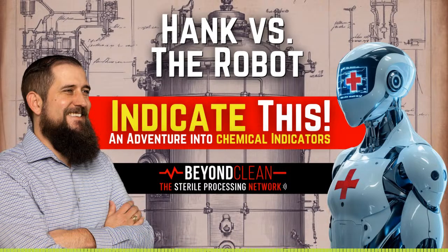Great starting point, Hank. You're absolutely right. There's a lot of confusion between chemical indicators and chemical integrators. So let's clear the air. A chemical indicator is like the basic gatekeeper. Its job is to tell you, hey, this load was exposed to a sterilization process. It's often single parameter, meaning it reacts to just one thing, like temperature or the presence of steam. Think of sterilization tape or those little stickers on the outside of a pack. They're great for confirming exposure, but don't dig into whether all the critical conditions for sterilization were met.